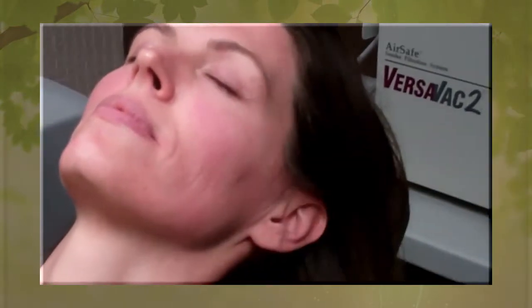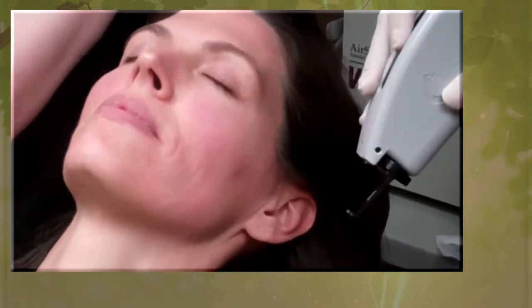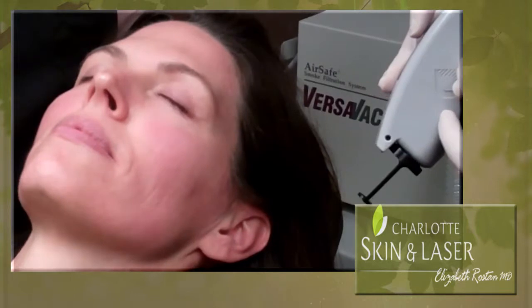Robin's going to immediately apply an ice pack after to make sure we keep the skin cool. You'll notice a little spray immediately before and after the laser beam that cools the skin as well.